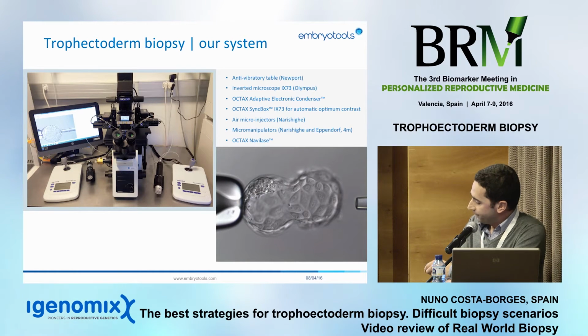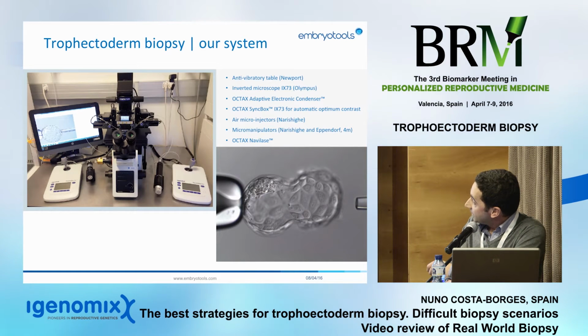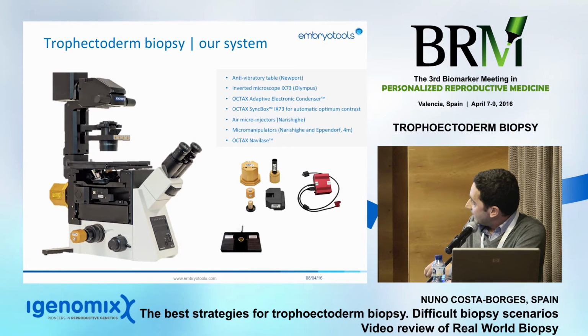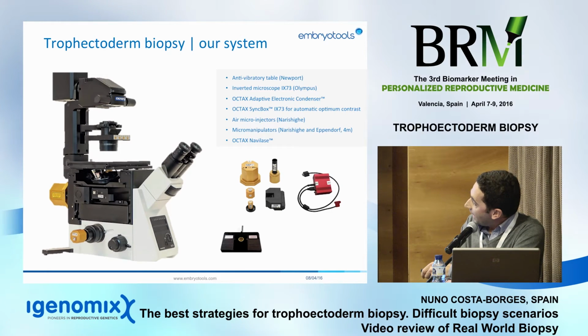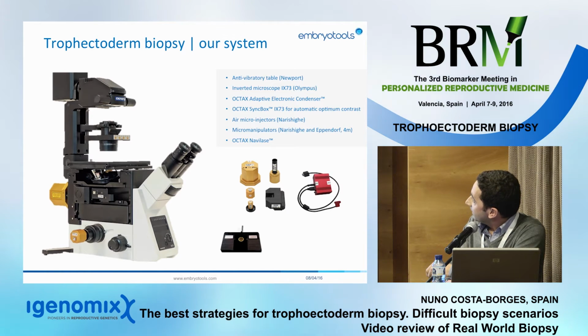And finally, we have of course the Octax Navi laser system, which is the latest in the market and is composed of different parts. This is the laser that is installed in the back part of the microscope. We also have the laser lens and the camera, and the pedals I was talking about.